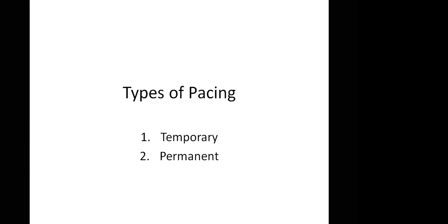We all know the defibrillator and the pad we use. Now, I want you to look at the left-hand side to see the markers on the defibrillator. You can see where they wrote pacer, rate, start, output. That's a defibrillator that can pace from the surface. The pacer means that you can pace from the pad that you put on the patient, and you can determine the rates at which you want to pace.